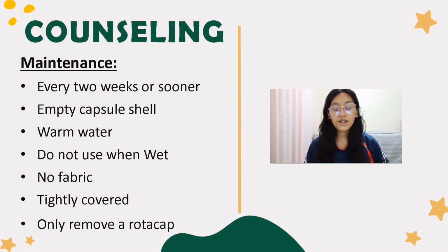For the next slide will be the counseling. For the maintenance, the Rotahaler inhaler should be cleaned once every 2 weeks or sooner if needed. Regular cleaning will prevent the powder from accumulating inside the Rotahaler. The empty capsule shell should be removed before washing the Rotahaler. Warm water should be used for cleaning and the device should be dry before reassembly.